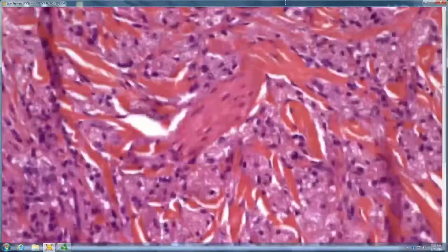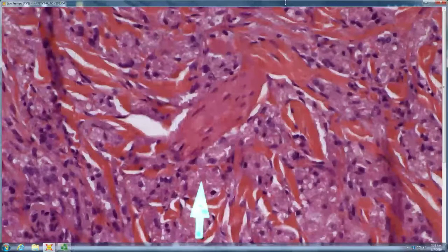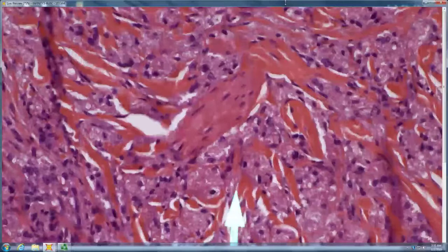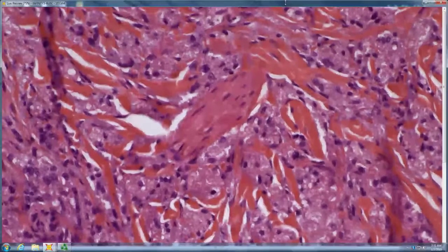This one is the color of an arrector pili, so we're suspecting granular cell tumor, and in fact when we look higher it is in fact granular, and it has giant lysosomal bodies which you can see sitting in a vacuole like that one right there. So that defines a neural granular cell tumor. There are non-neural granular cell tumors as well, but those do not have overlying acanthosis, and don't have giant lysosomal granules.